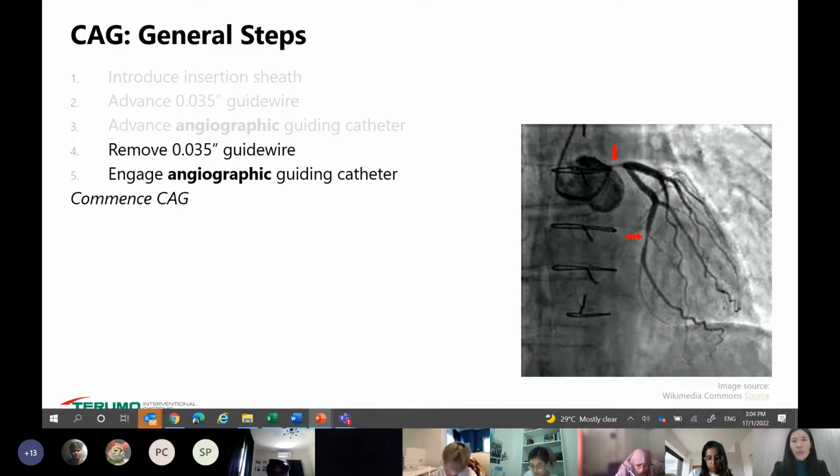Okay, so like what I mentioned just now, here you can see in this angiographic image, again for your left coronary artery, that the start of your left coronary artery is already very pinched. It's already very thin, right? And down this artery, you can also see another pinch. So typically, you can see here this artery is fine, right? It's not pinching anywhere. It's getting big to small very smoothly.